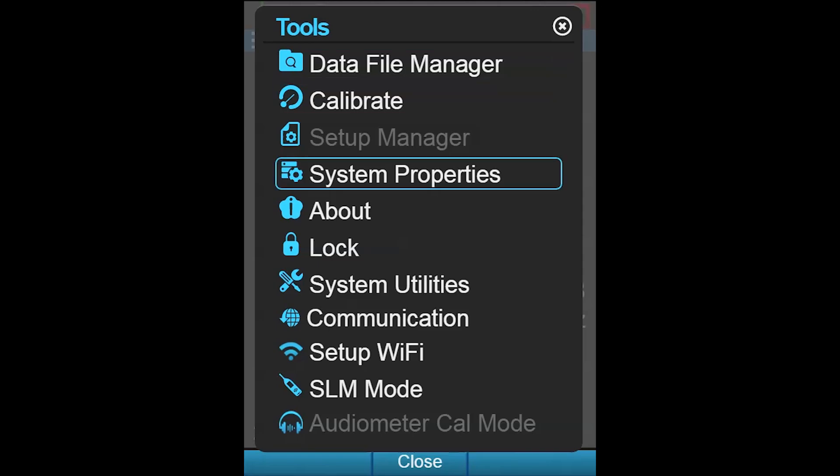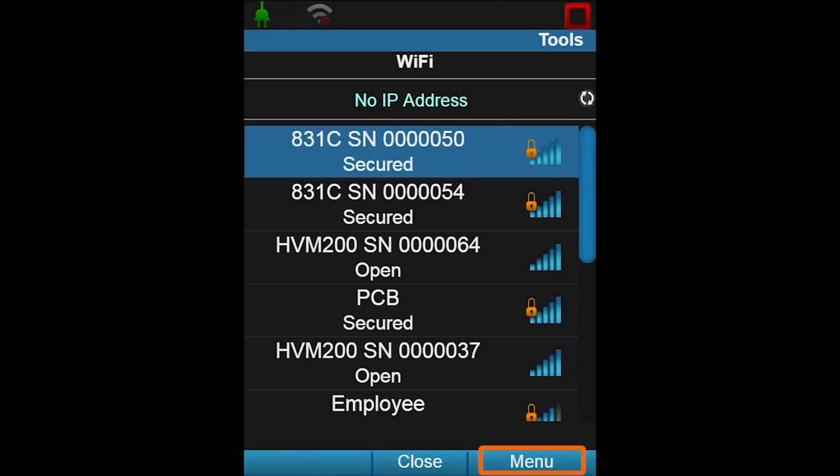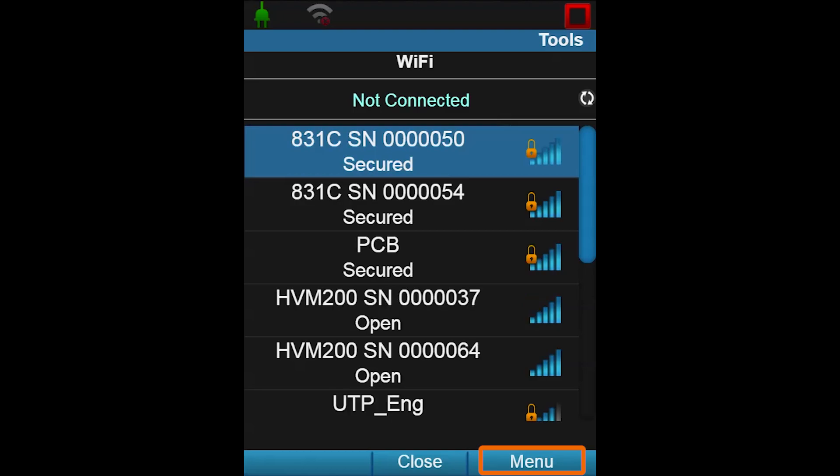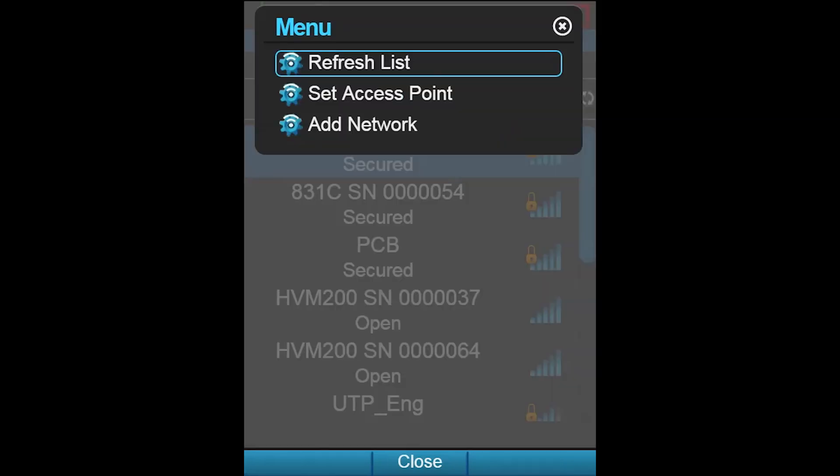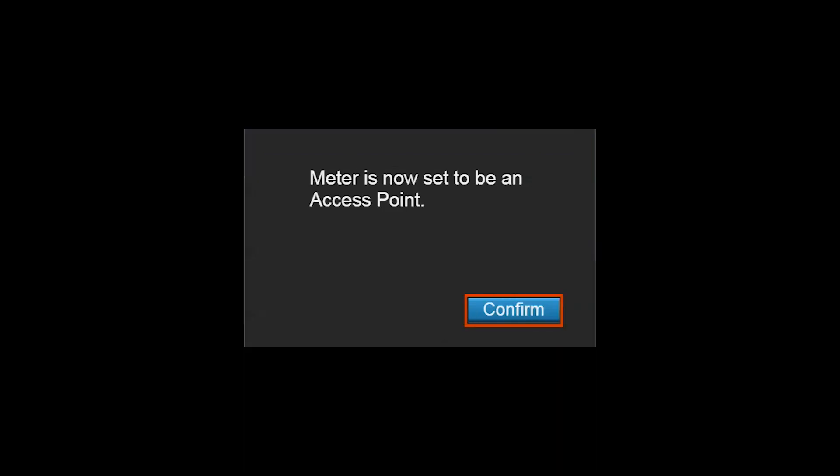Just navigate to the Tools menu, then to Setup Wi-Fi, select Menu, then choose Set Access Point. It will stay in this mode, so you only need to do this one time.